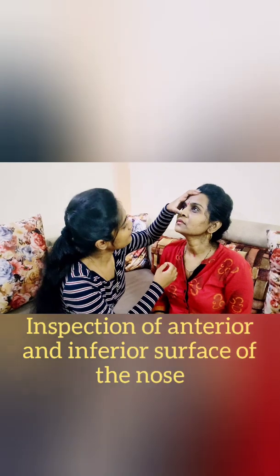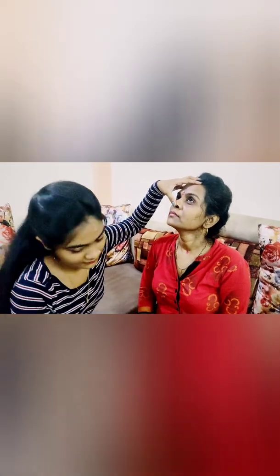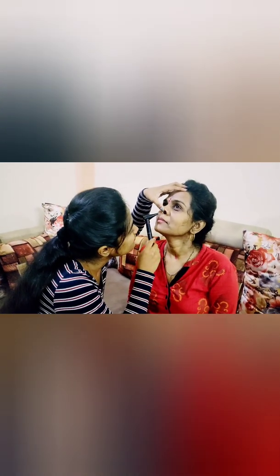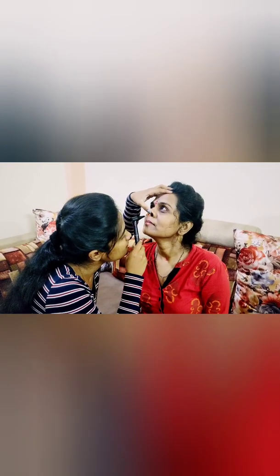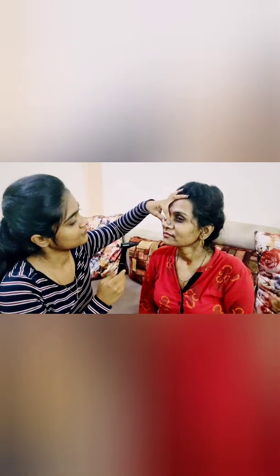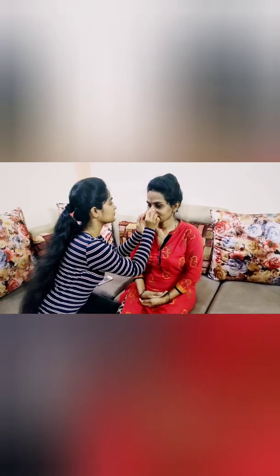So first I'll inspect your anterior and inferior surface of the nose. Gentle pressure on the tip of the nose with your thumb usually widens the nostrils. Use a pen light or otoscope light to obtain a partial view of each nasal vestibule. If the nasal tip is tender, be gentle and manipulate the nose as little as possible. Note any asymmetry or deformity of the nose.